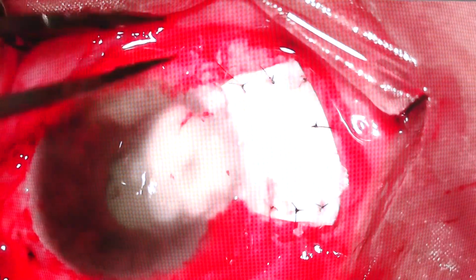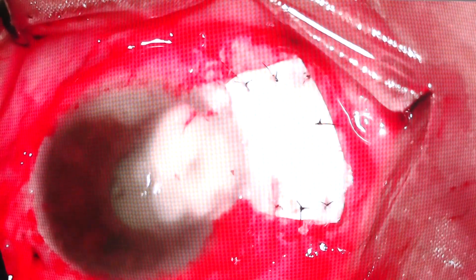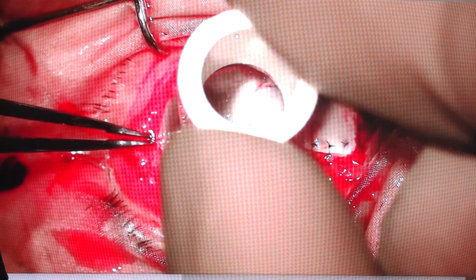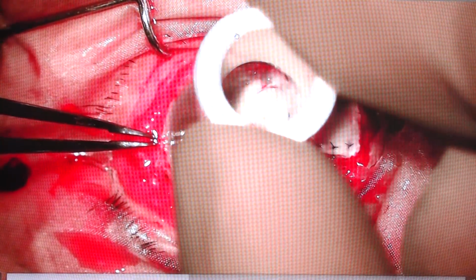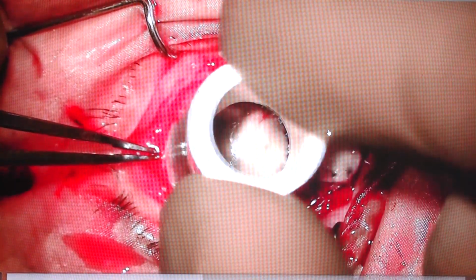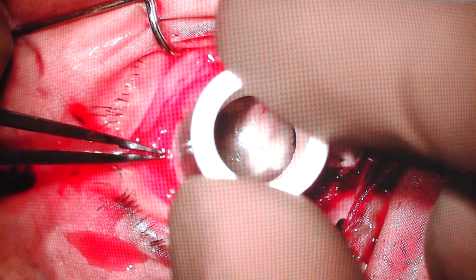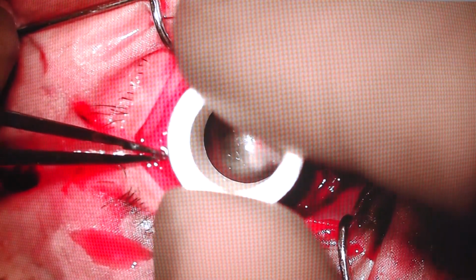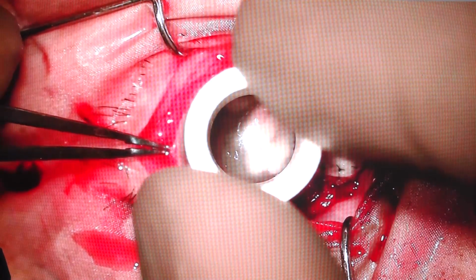Now we are anchoring; you have to try and thin out the scleral patch graft as much as possible. The conjunctiva was badly necrosed, so the problem was how to cover this patch graft, because conjunctival advancement was not possible. This was very close to the nasal side, and pulling of that would have incited more issues, maybe restriction of the ocular movements.